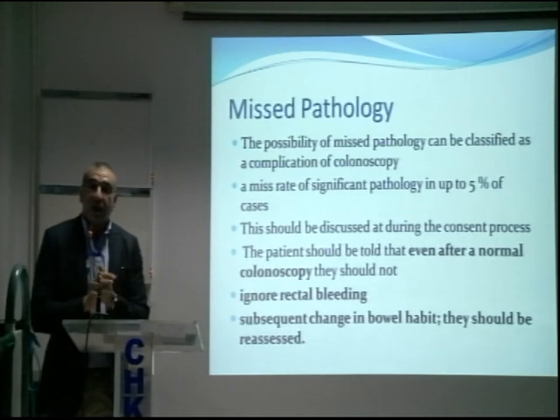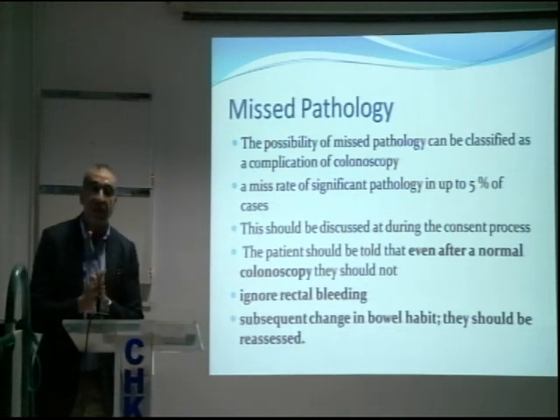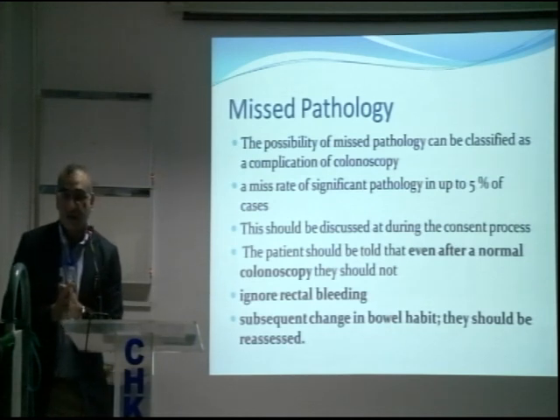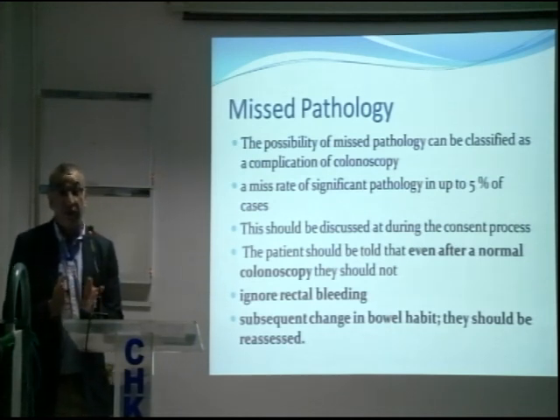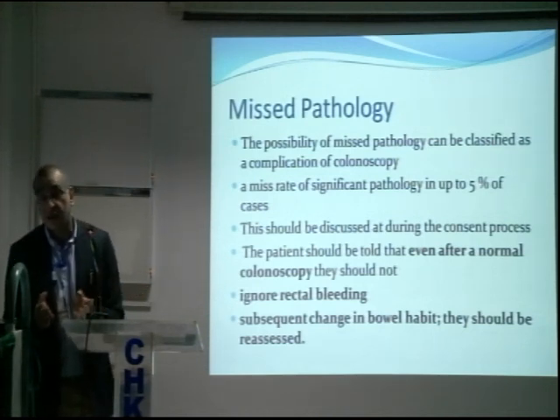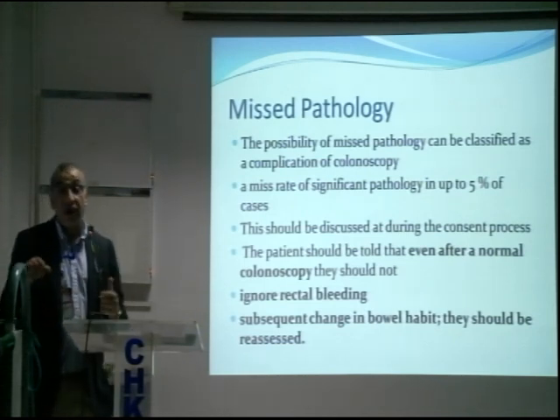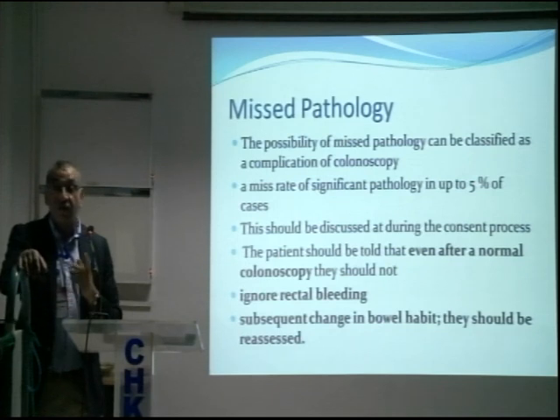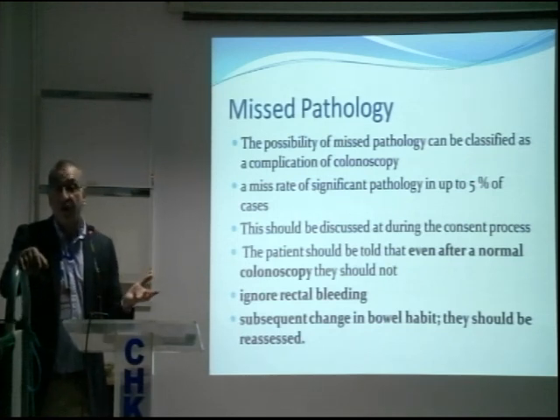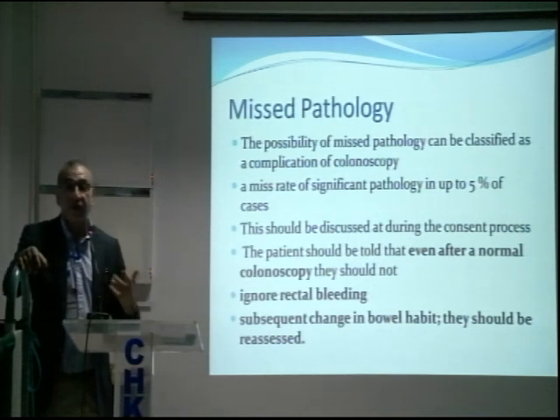Again, even in the best of hands, a colonoscopist's ability is determined by his adenoma detection rate. The minimal requirement is about 10 to 20%, I think, and people who are good, their adenoma detection rate is above 40%. We all operate around that level, right? If you do 100 colonoscopies, in 40 of them, you would detect a polyp of some sort. The better your adenoma detection rate is, the better your skills.